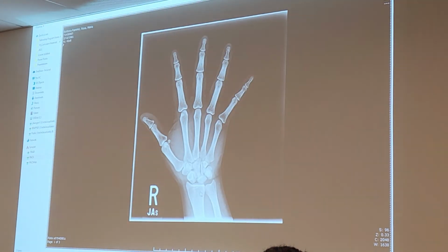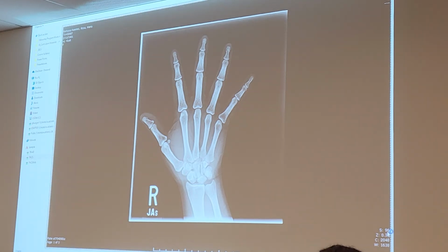Oh, look at that marker. CR, Fujifilm. Now, this is an accurate S value. S value of 96. Extremities, I said, should be between 75 and 200. So, is this in range? Yes. Let's take a look at our next image.